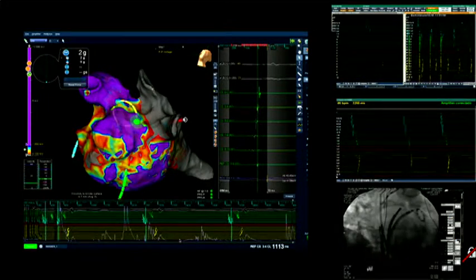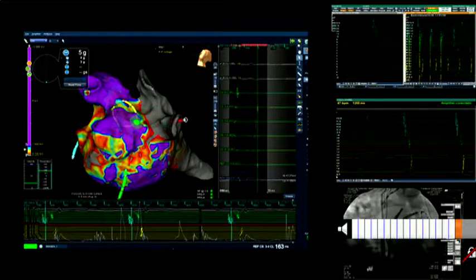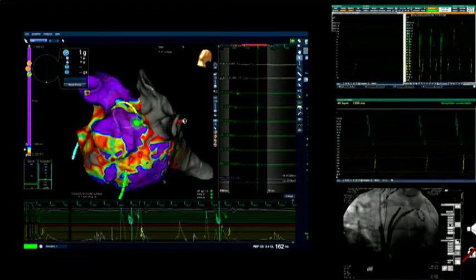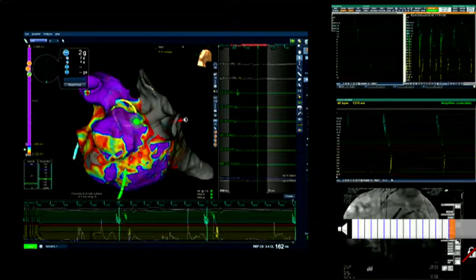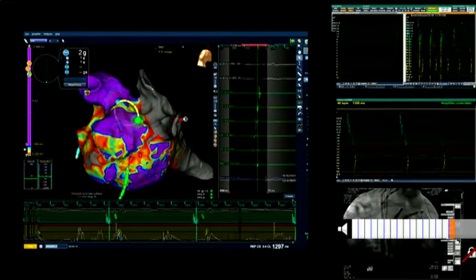Miguel, ¿podría explicarnos? Bueno, se ve que hay una señal unipolar. Pongan solamente los electrogramas. ¿Qué tanto? Pon solamente los electrogramas, la pantalla.